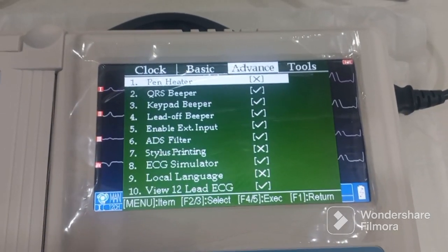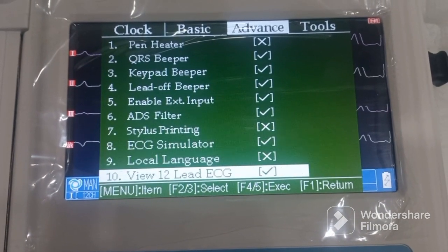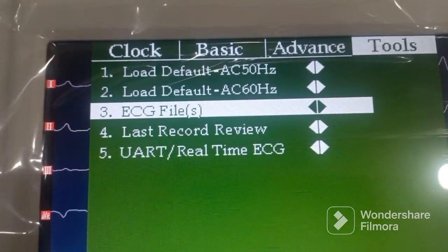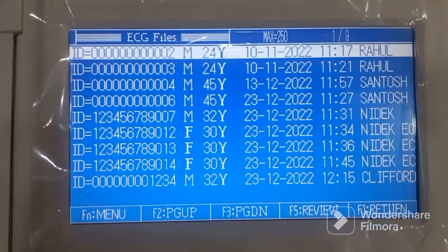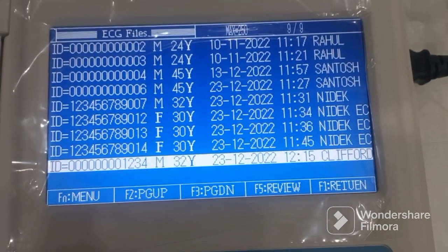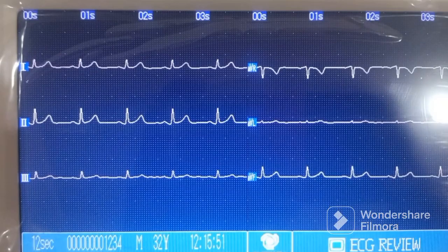In the advanced settings there are options like pen heater, QRS beeper, keypad beeper, and more. Under tools you can access the saved ECG files. Once you go there, press the right navigation key and you get all the saved data. You can navigate down to find the ECG by patient name, then press the right arrow to view the saved ECG.